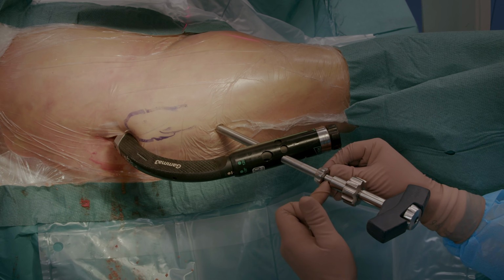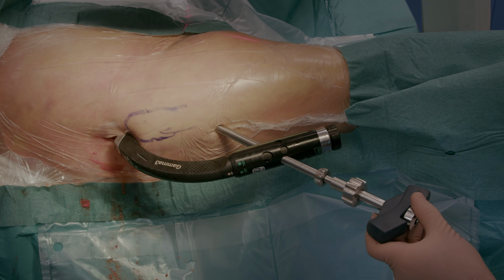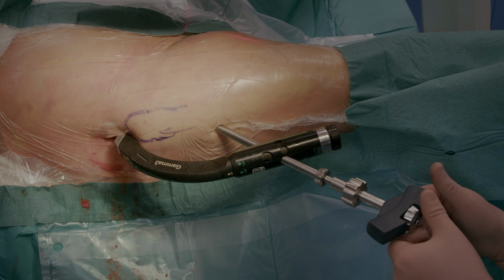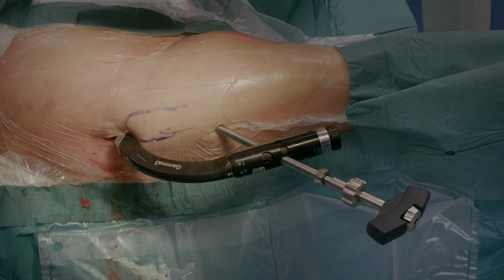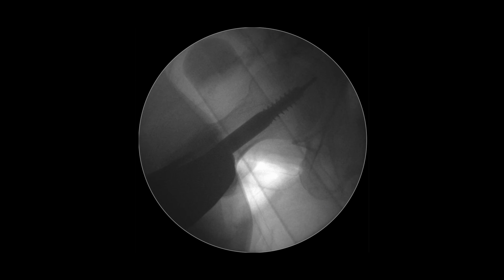Now, when this mark on the insertion tool comes exactly flush with the guide, the depth should be just correct. The depth appears to be good in the image as well. Then we confirm the appropriate location of the screw also in the lateral view. This appears to be fine as well. We can lift up the C-arm.